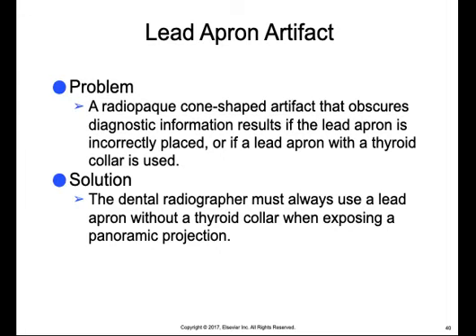So if this happens even though you're not using a thyroid collar, you can just position the lead apron so it's lower around the patient's neck.